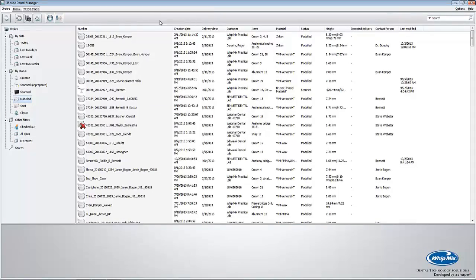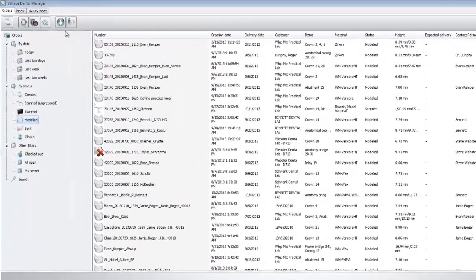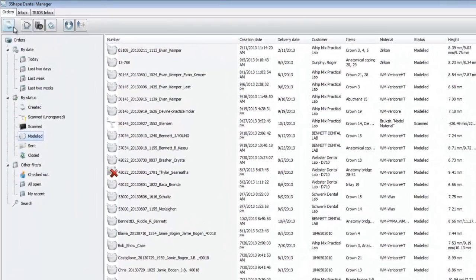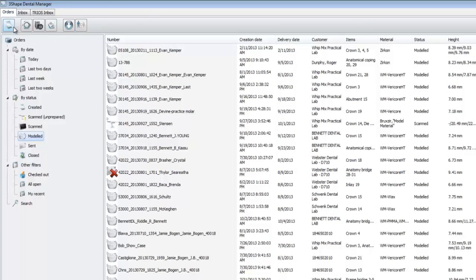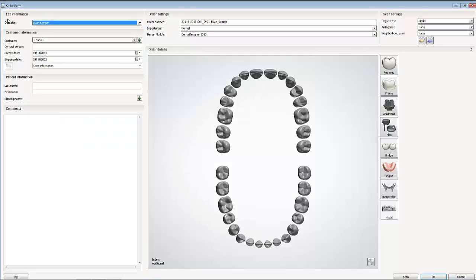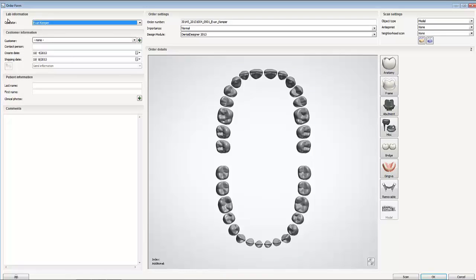To create a new order, we click on the paper icon at the top left toolbar under the orders tab. This will create a new order. Once the new order loads, you'll see a form. This form is where you specify all the information 3Shape needs to set up an order.